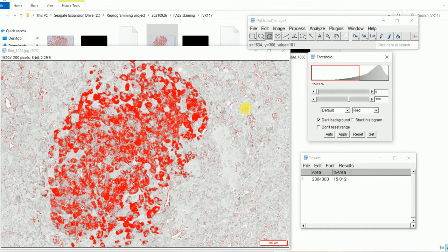To get rid of that background, what you can do is simply click on this one, and then just select, for example, let's say that this area becomes red, but this is not my intended area. You just click it like this, and click it here, right? And then you will go to Edit, and then you will cut it. Even if you do it, your total area will not change because it will be the same, and you just got rid of the extra background area that was falsely stained red while doing quantification, but originally that was not red, so you want to get rid of that area, so you just do it like that.